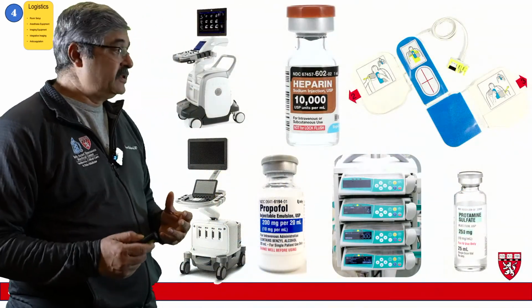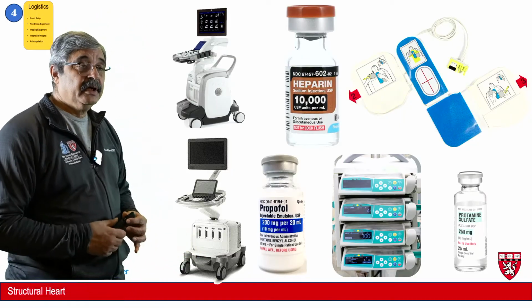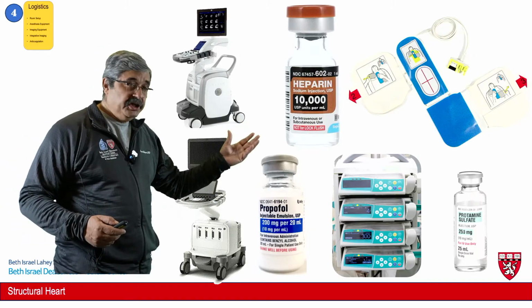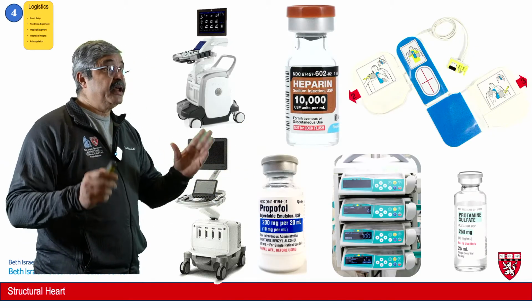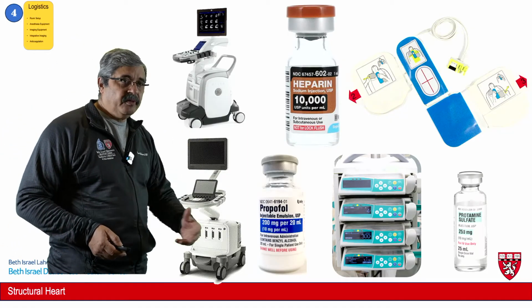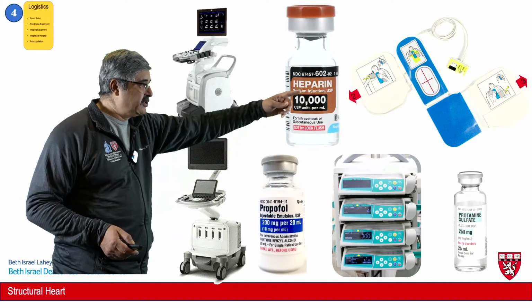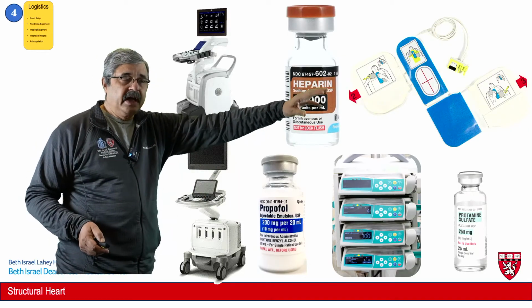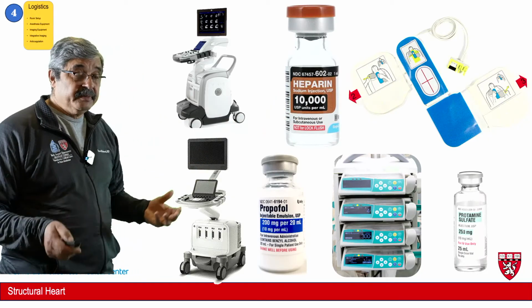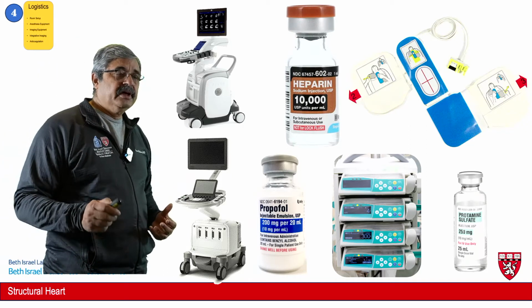I have no specific predilection for any echo equipment. We have Siemens, we have GE, Philips equipment. We can use any one of them, but it has to be capable of three-dimensional imaging. You have to have heparin, propofol, protamine, a lot of pumps, and above all, the ability to cardiovert and defibrillate the patient. And we, as a protocol, apply these pads before we start, because the chances of either arrhythmias or ventricular fibrillation are high because of all these moving catheters, and therefore we use that in this fashion.